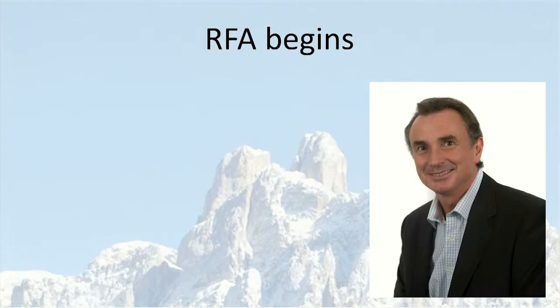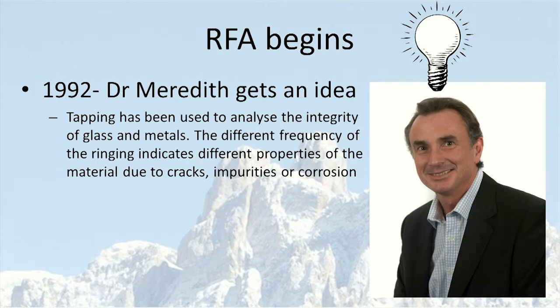So it all started with this guy, a good friend of mine, Neil Meredith, who in 1992 got an idea. At that time he was at the Eastman Dental Institute in London. And the idea he got was from another part of industry. Historically, tapping has been used to analyze the integrity of glass and metals. By tapping on the glass, you will have a ringing sound. And the different frequency of that ringing sound indicates different properties of the material due to cracks, impurities, and corrosion.